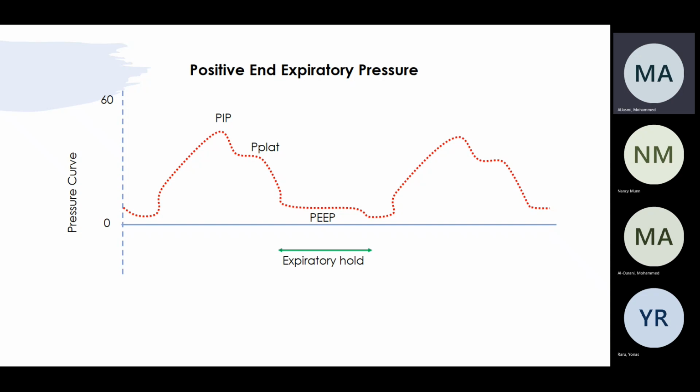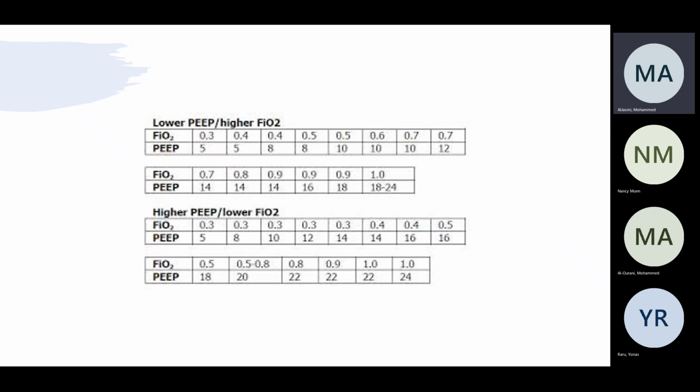But if there's a lot of effort, like you are doing an expiratory hold but the patient is not holding and is making a lot of effort, or the valve of the expiratory hold is not working well, you will see some leak, so don't just take it number-wise. The machine can make mistakes. We built the machine, is that right? All right, so that's the PEEP.